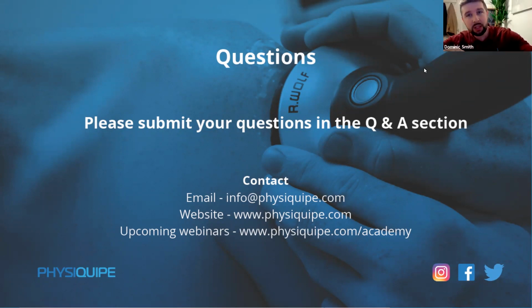So the focal zone for the system that he's got is 10 millimeters in height. The central point is where your depth is, that's where it's set to. So you're going to have 5 millimeters either side, so you're going to be affecting tissue between 5 and 15 millimeters. I hope that makes sense. If you then use the 20 millimeter gel pad, you're going to be affecting tissue between 15 and 25. And that's just in the main focal zone. You do have some extra areas as well in the -5 megapascal area, I think. I can't remember the exact details, but you do have some effects. But yeah, I'd use both, and you'll definitely be hitting it then.